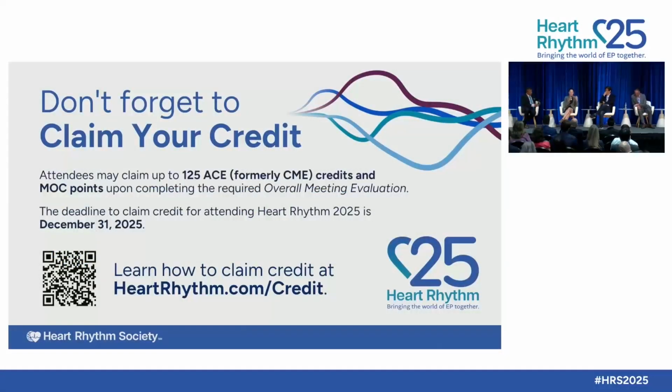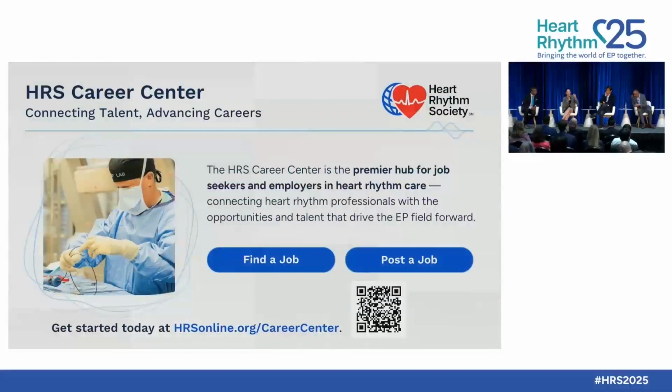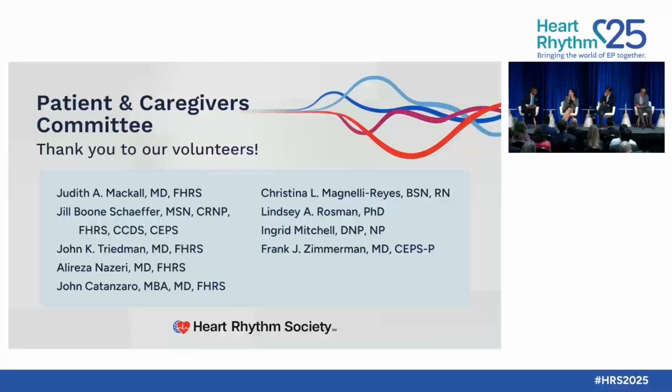And at least in the animal world of AF mapping, if you extend your AF ablation lesions to a non-conducting border, which is what we do with our common sense in clinical practice, let me continue that to a posterior wall isolation or to the annulus of the mitral valve or the tricuspid valve. I think that is definitely the right thing to do. I think we have good evidence from animal studies with optical mapping of what happens with limited ablation versus if you extended ablation to non-conducting borders. And I think that would be my strategy. I think that was the strategy in the tailored AF as well.